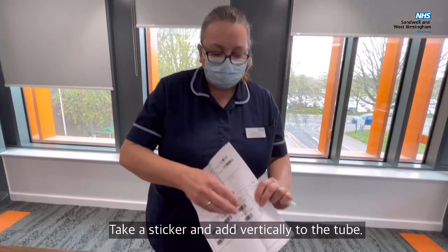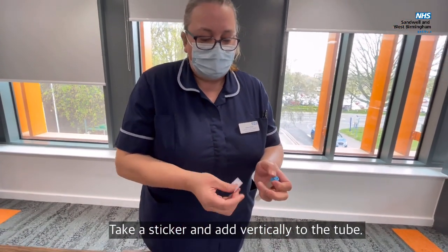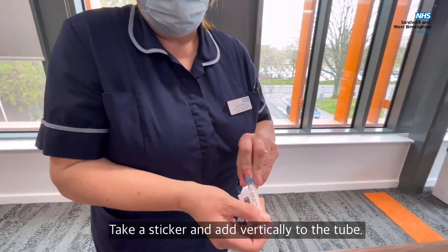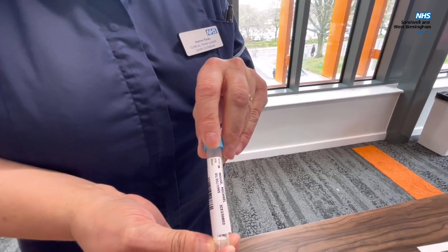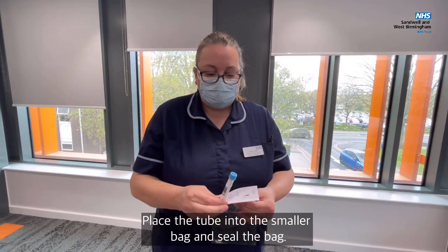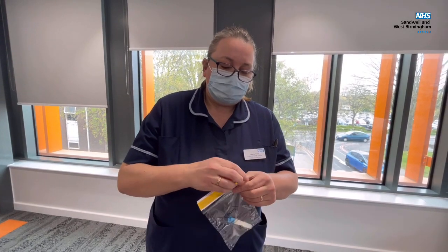Then you need to take one of your stickers and apply that vertically to your pot. You're going to place your tube in the first bag and seal the bag.